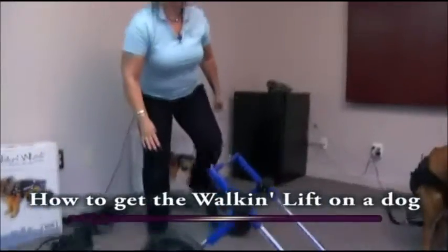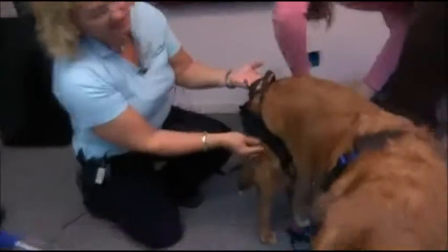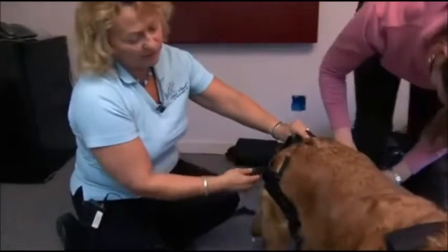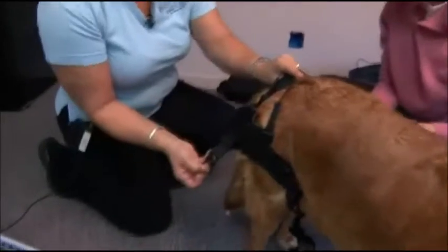We've already put one on Jake over here. What we did was put his legs through the holes and then crisscrossed it at the top to hold it on. These are the round rings that are going to clip right into the cart.